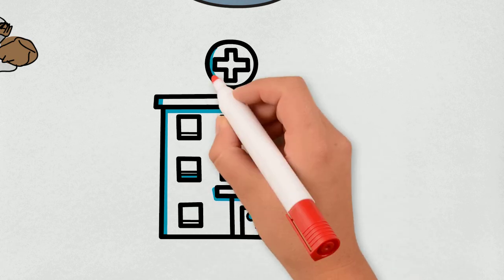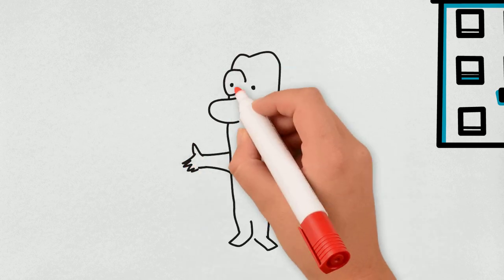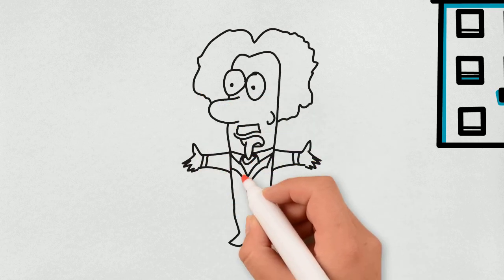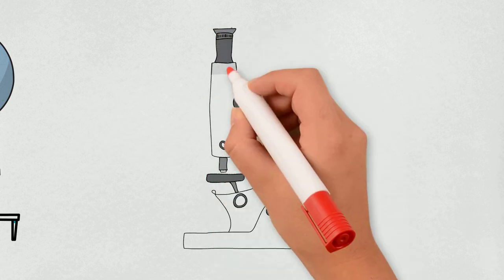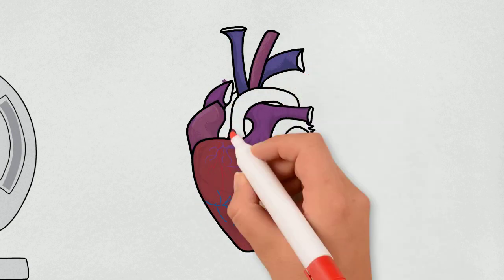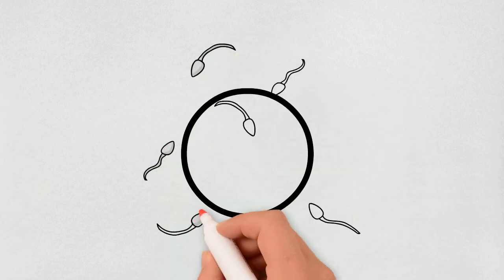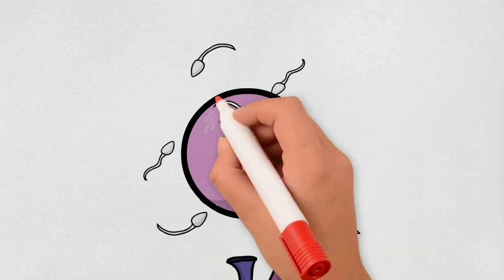It was a relatively small group of pioneering neurosurgeons in the late 1950s and 1960s who transformed microneurosurgery from a revolutionary and unorthodox experiment into the standard of care in much of modern neurosurgery. Now, neurosurgeons are able to use better microscopes even when dealing with really delicate organs. The basic principle behind it is that it uses a set of lenses just like a regular optical microscope, but it is accompanied by modern live digital imaging. The earlier version basically functions like the normal stereo microscope.